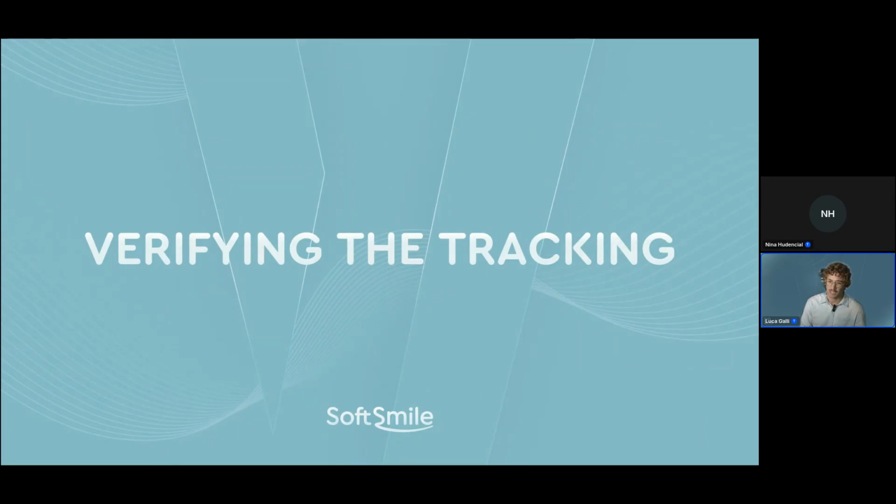So the key point is that when an aligner stops tracking, it's not just a small detail. It changes the starting point for every single movement that comes after. So we want a way to detect problems early and respond before the case drifts for weeks.